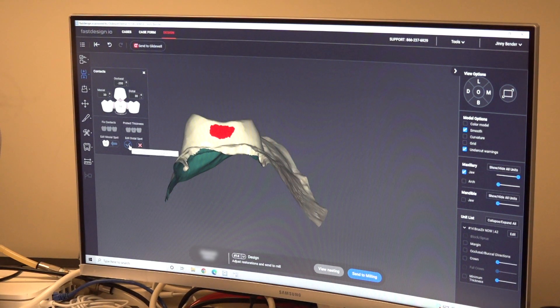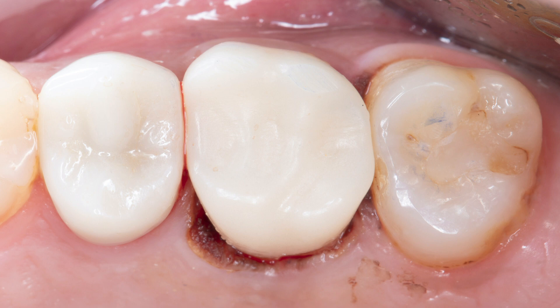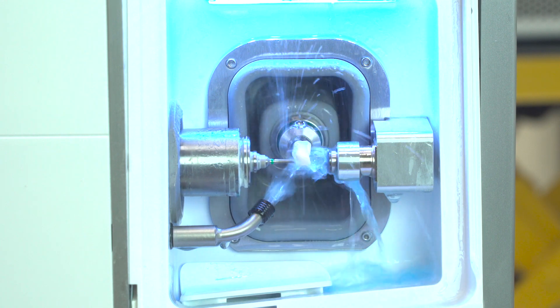The FAST mill fabricates a custom same-day BioTempNow in about 10 minutes. It is cemented with Tempon Clear Provisional Cement. With the same BioTempNow design, a BruxerNow crown mills in less than 40 minutes.